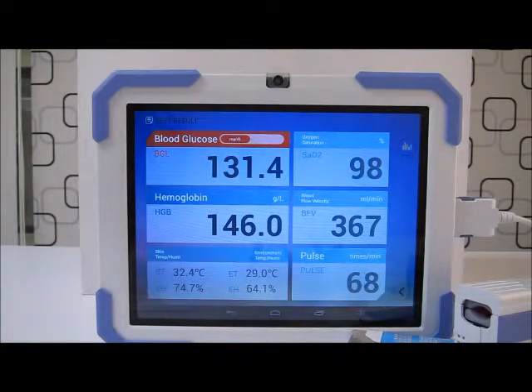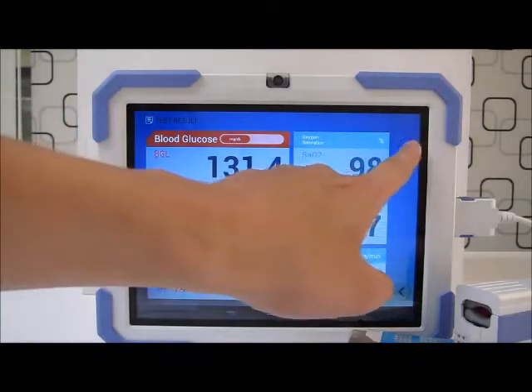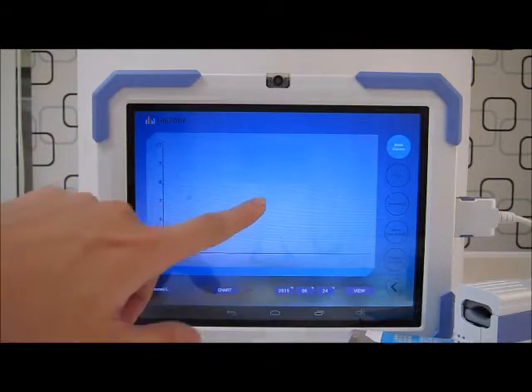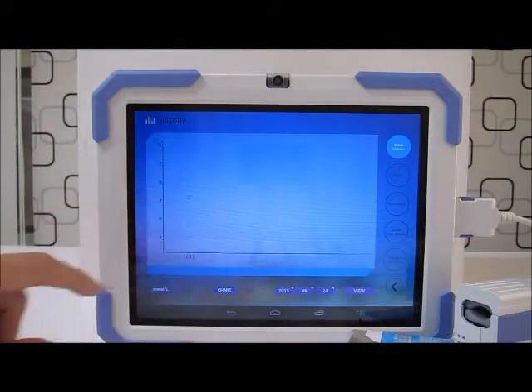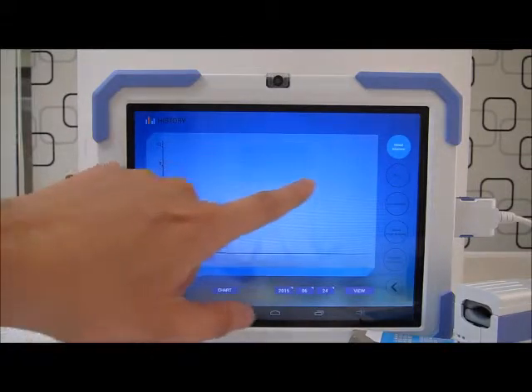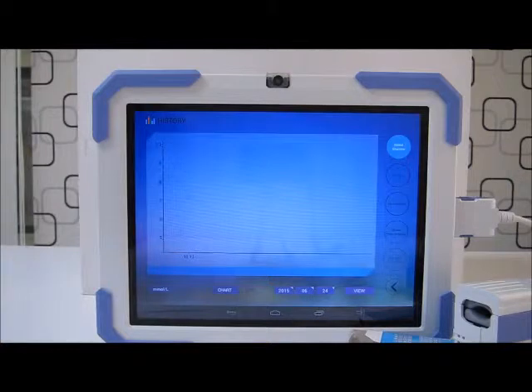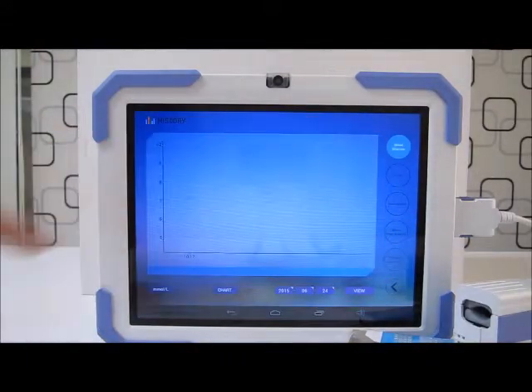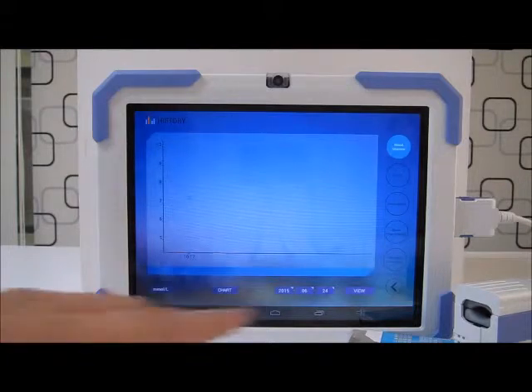I have diabetes so I need to test more than once a day. I can press the upper right button — View Local Data. The computer tabulates my results as a graph, which makes it easy to keep track of my blood glucose as well as other health indices. It's a very simple and easy tool to keep track of my personal health.